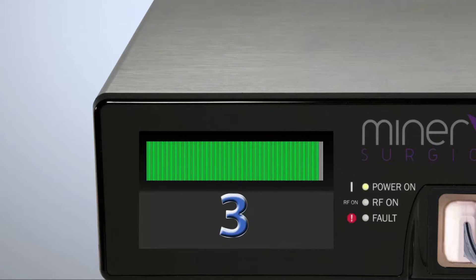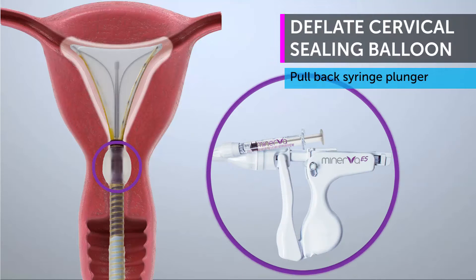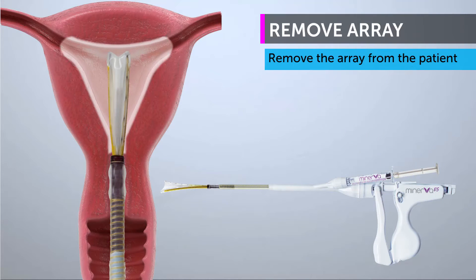Every patient receives a 120-second treatment. The ablation is now complete. Deflate the cervical sealing balloon by pulling back the syringe plunger. Unlock the handle to collapse the array and remove the array from the patient.